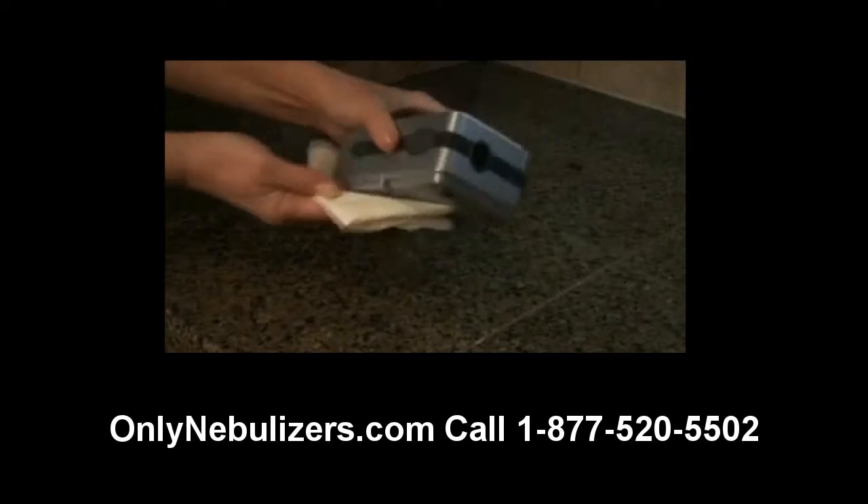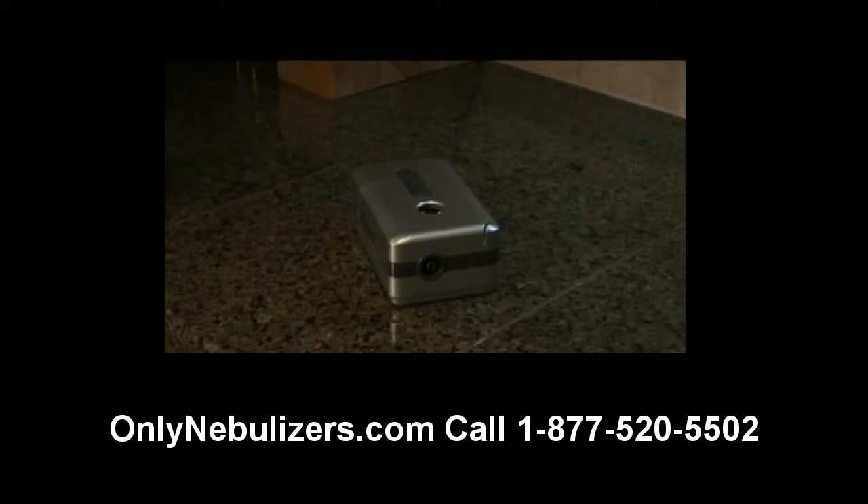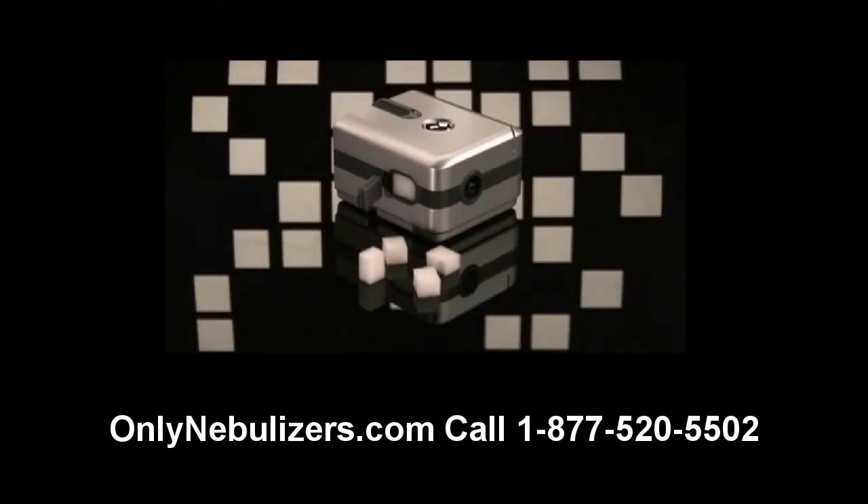Remember to clean your compressor every few days with a damp cloth to keep it dust free. The traveler compressor filter should be changed at least every six months, sooner if the filter is discolored.